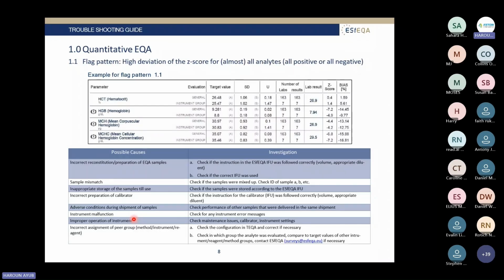So for ALT, it will give you a highlight on your end, depending on which machine you are using. For our machine, it will give you an alert, pipette error. If you ignore that particular error, it might be that the pipette did not pick the sample appropriately. So you need to rerun before submitting those results. You can check that. That's when you come and rerun that particular sample, you get very good results, and you're wondering how it could have been.